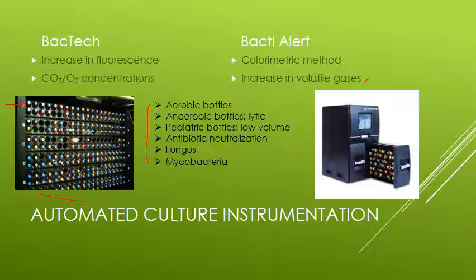And when you're talking about TB, you really want it fast, so that you get the patient into precautions, but also isolate the patient is what I'm trying to say. Precautions. There are difficulties with each system.